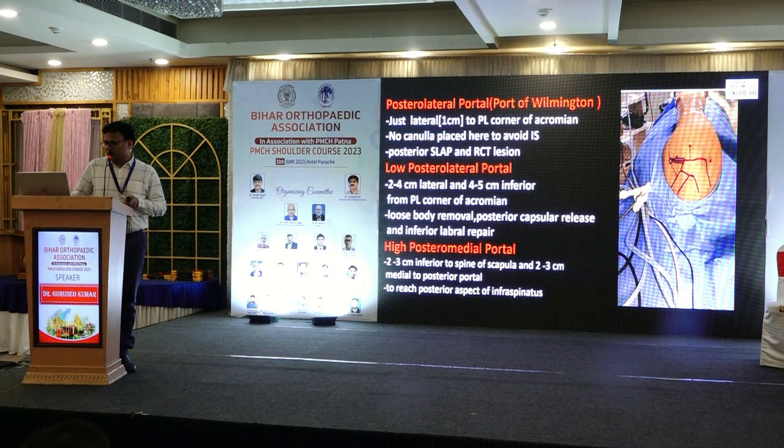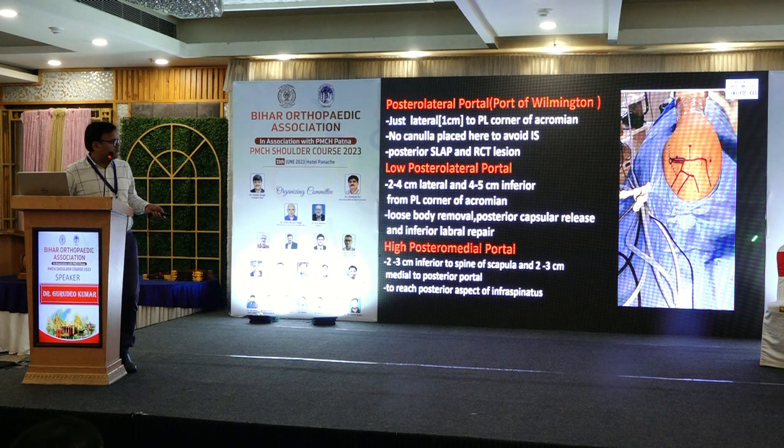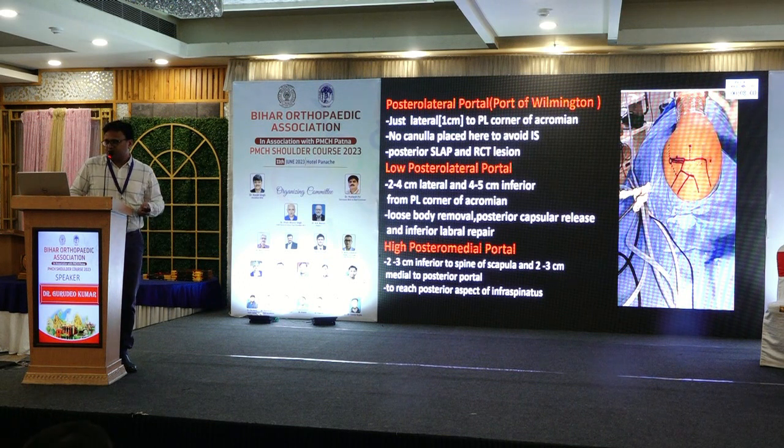Low posterolateral portal: it is located 2 to 4 centimeter lateral and 4 to 5 centimeter inferior from the posterolateral edge of the acromion. It is located here, and it helps to remove the loose body from the axillary pouch, posterior capsular release, and inferior labral repair.